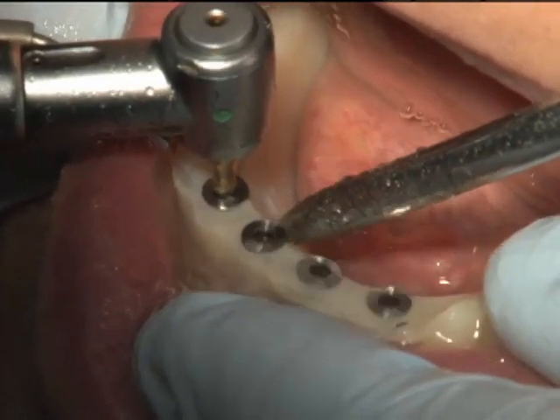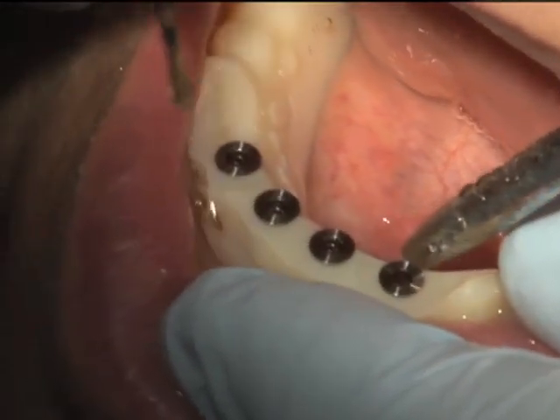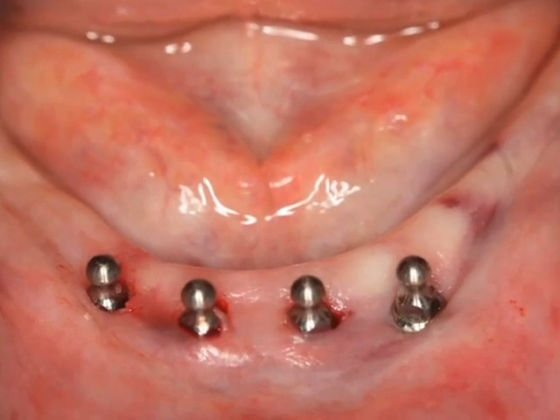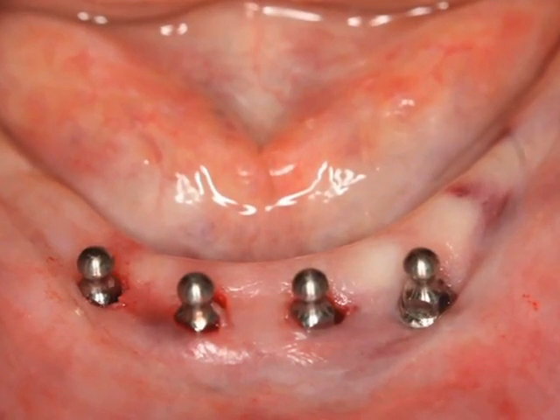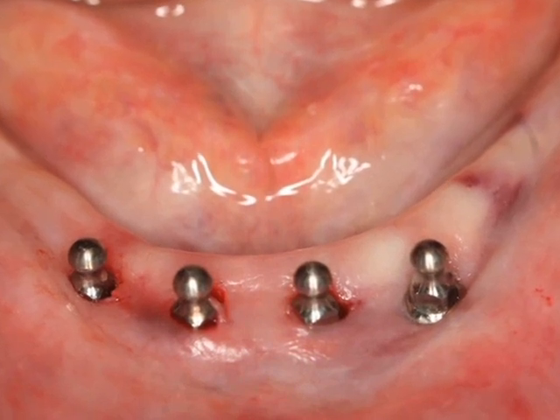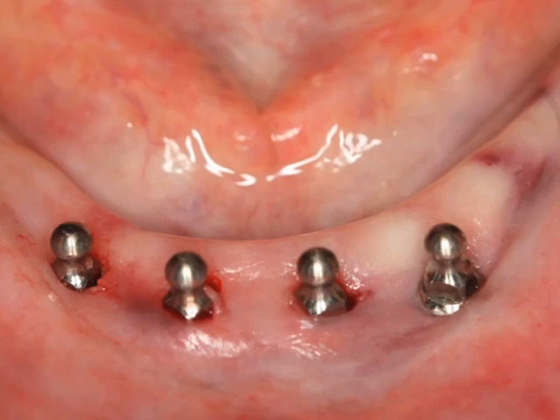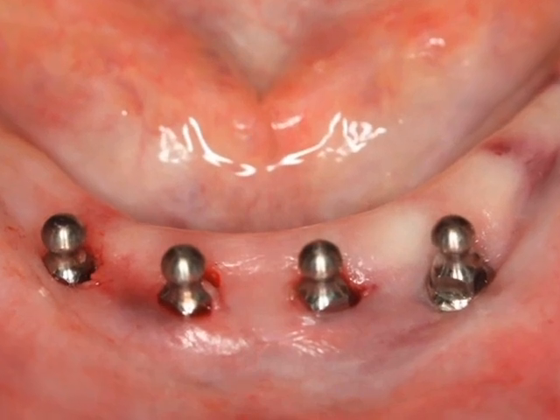Finally, the software allows for surgery to be less invasive and more predictable because there is no longer a need for a full thickness flap. Instead, the implants are placed using a flapless approach, which we will demonstrate in this program.